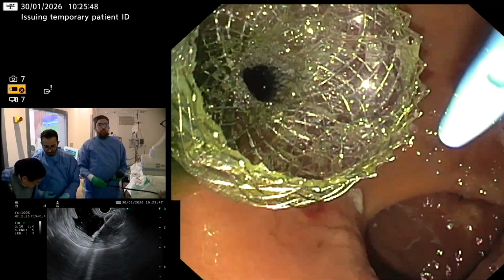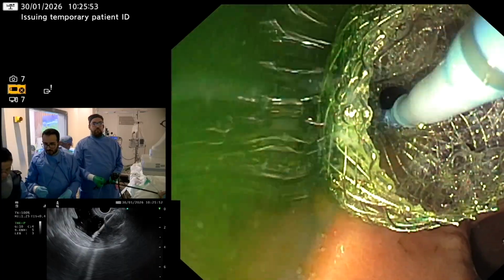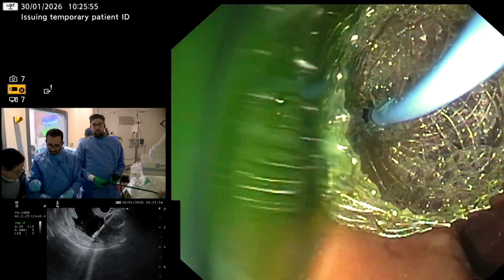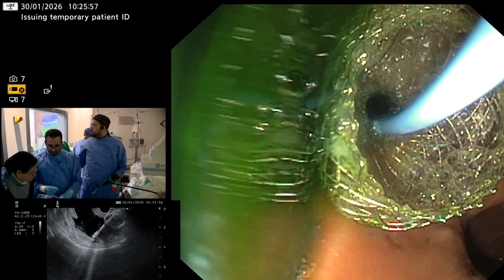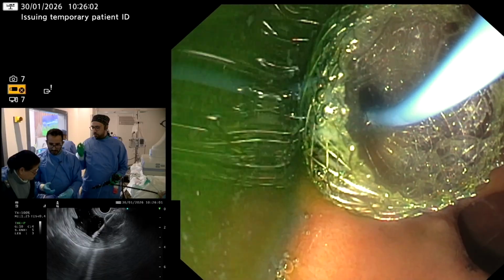Yeah, I think it's very important to communicate with the surgeon. We also had a case last week, and I spoke to the surgeon exactly about why we do this cholecystectomy in-house, and they're very accommodating. Just 1 minute. Happy that they didn't have to look at it properly.